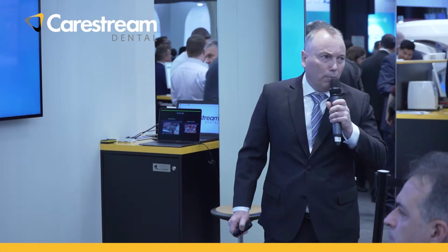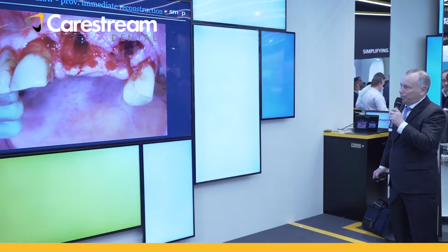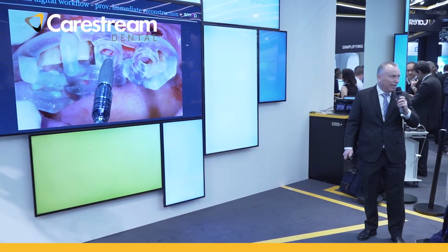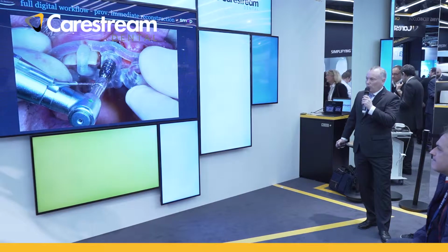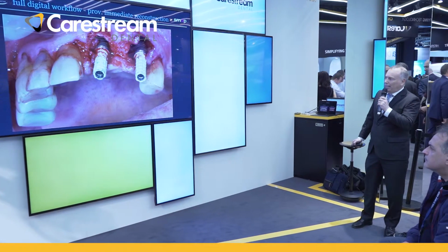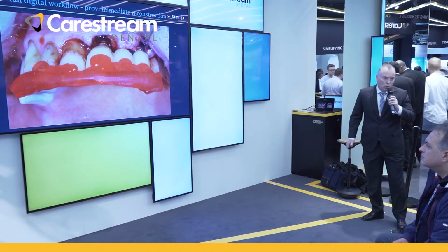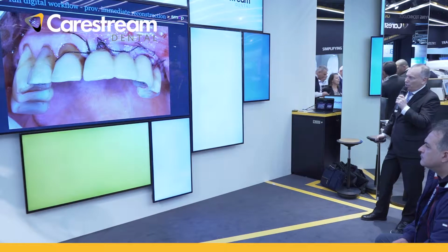We placed 2 Straumann implants with these little handles. You see the osteotomy for the 2 implants now. Then we also place the implants fully guided. The cooling is really nice also with the template here. And then these 2 abutments, the try-in of this provisional bridge. We had a little help to glue them in, so that the bridge is in the right position. This was just after the surgery.